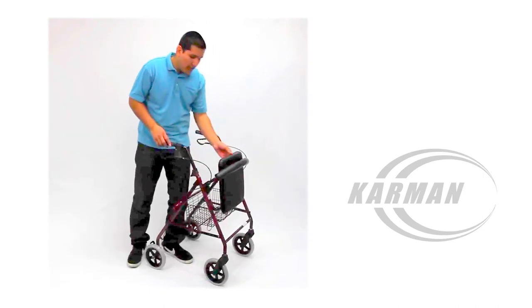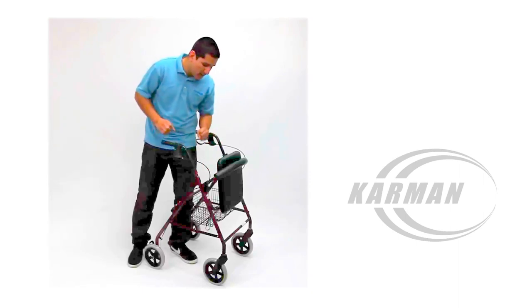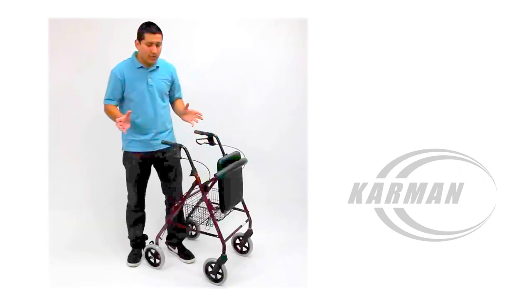This Rollator is foldable. As always, you take out the wire basket, fold it up, and you're ready to go.